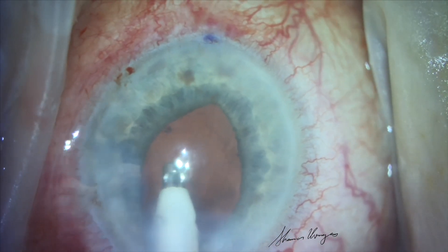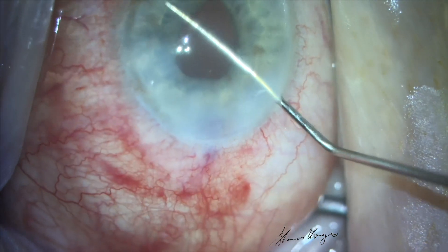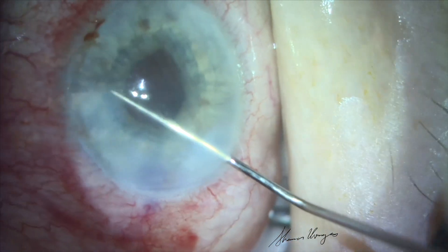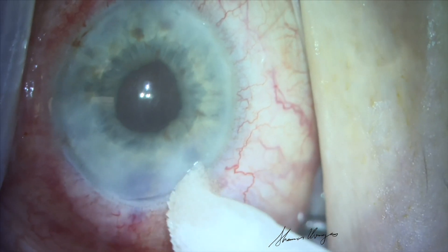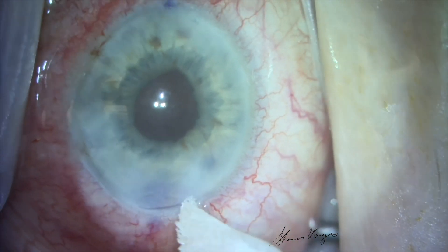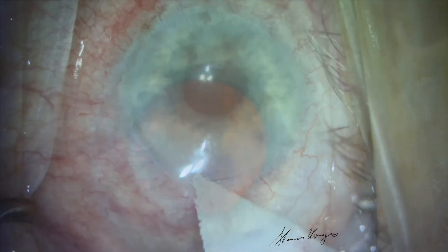Anterior vitrectomy is repeated. The incisions are swept to identify any remaining vitreous in the anterior chamber. Ultimately, we decide to leave the patient aphakic, let the eye heal, and then place a posterior chamber monofocal lens on a later date. This is the appearance of the eye at the end of this difficult case.